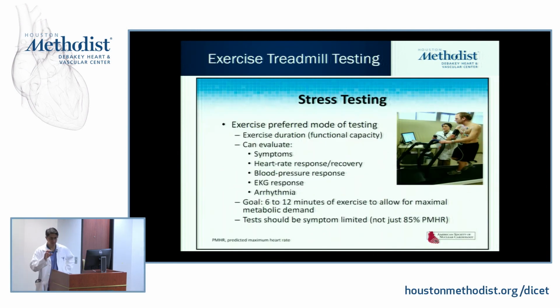Okay, so that's kind of like the principles behind what we do. Now let's get a little bit into the day-to-day clinical aspects of nuclear imaging. So stress testing, the exercise treadmill testing, this is a test we like to do. Why do we like to do it?